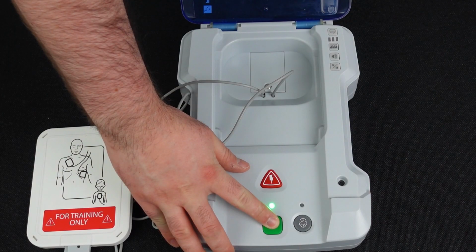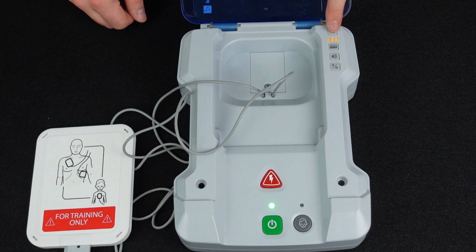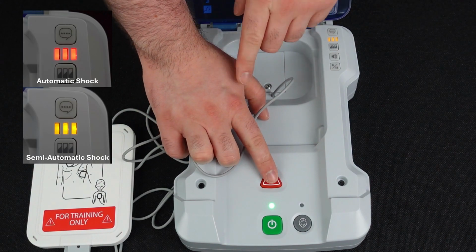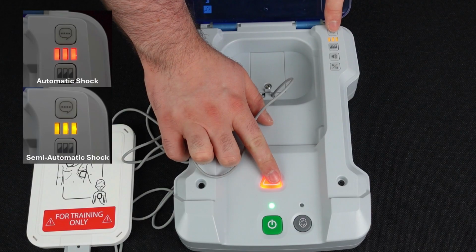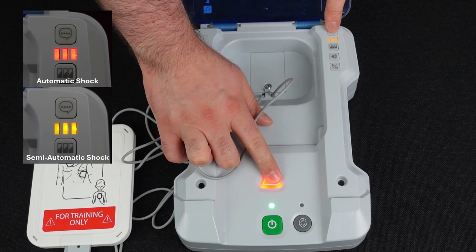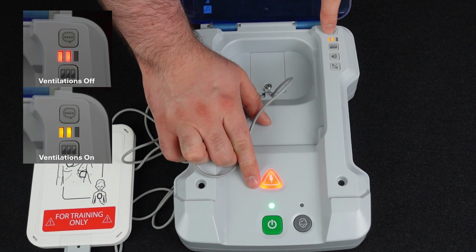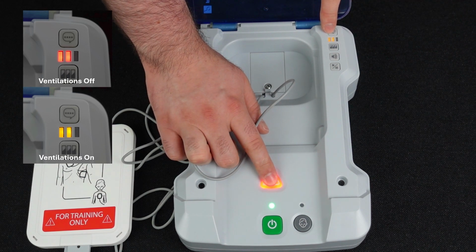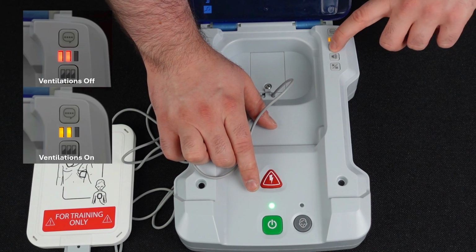Here you can change the shock, ventilations, and metronome settings by hitting the scenario selection button. Click the red shock button to turn a setting on or off. When there are three lights illuminated, you are choosing between the semi-automatic or automatic shock. Click the scenario selection button to go to the next setting once you have made a selection. When two lights are illuminated, you are switching between ventilations on and ventilations off. Click the scenario selection button to move on.